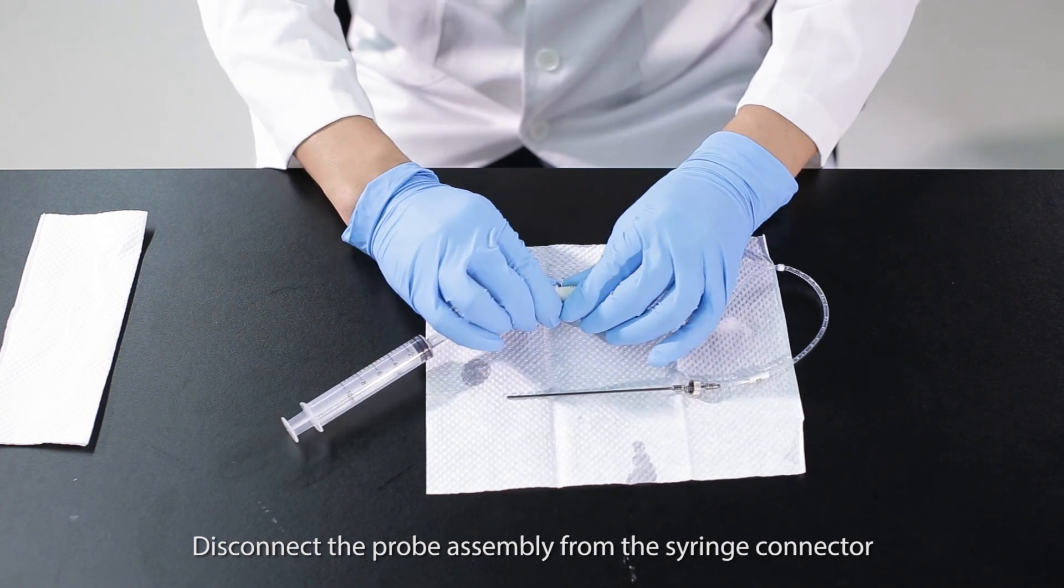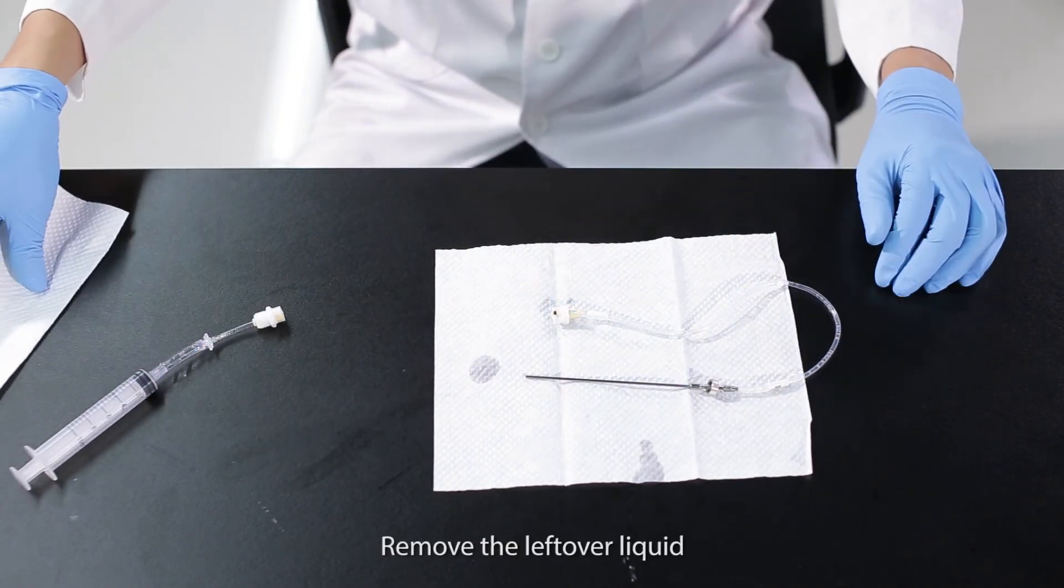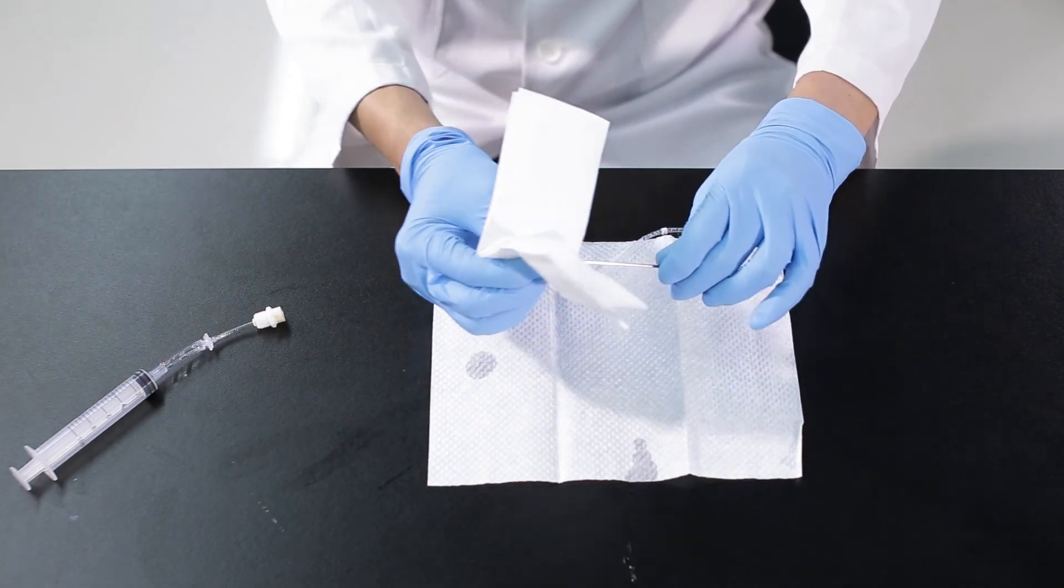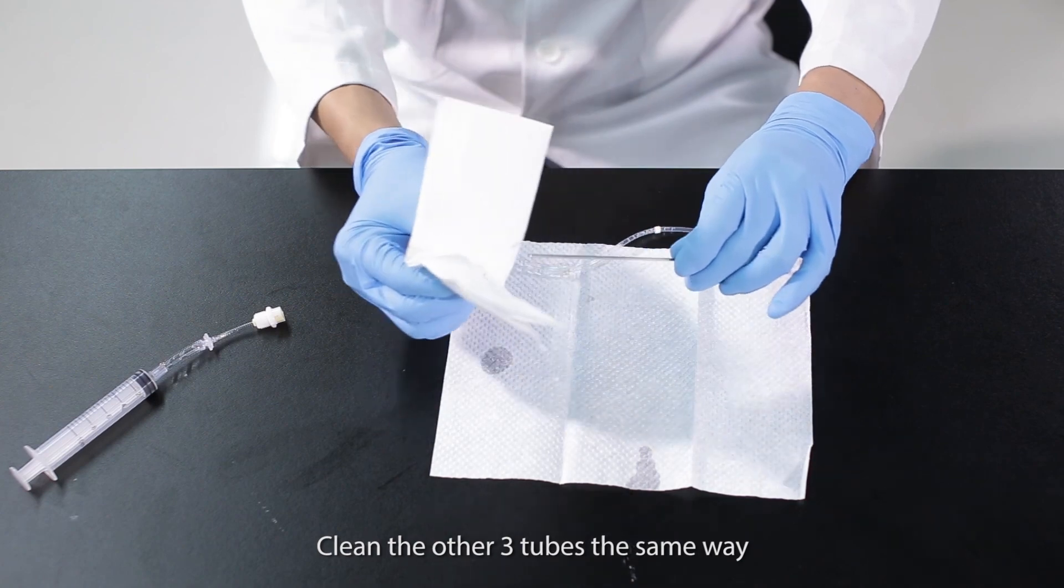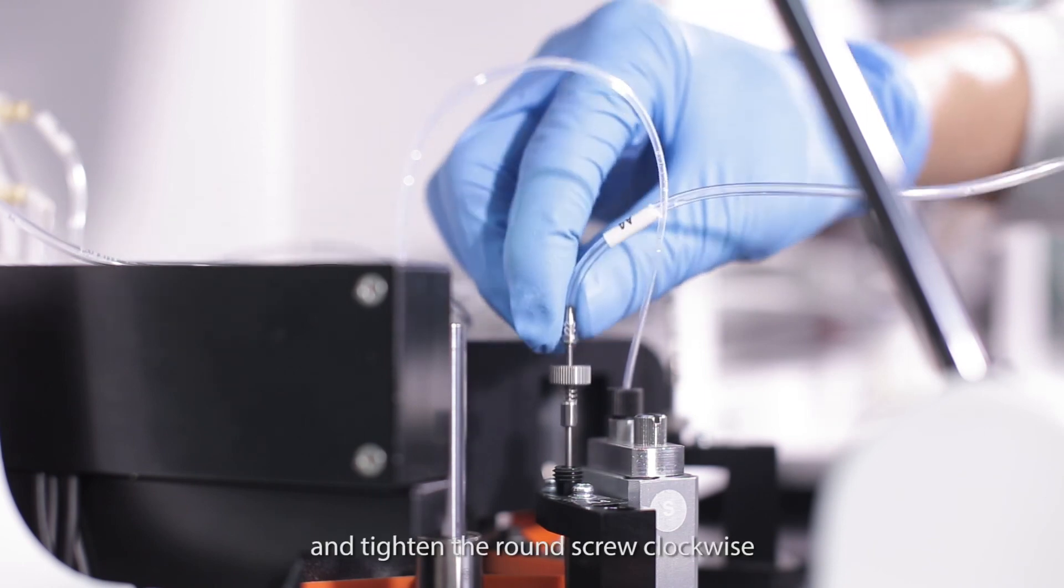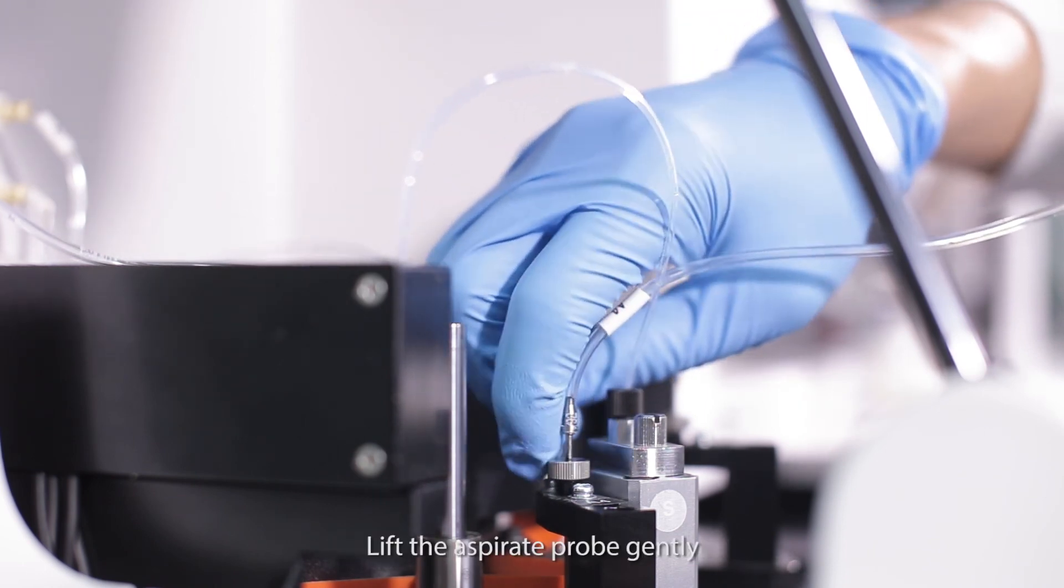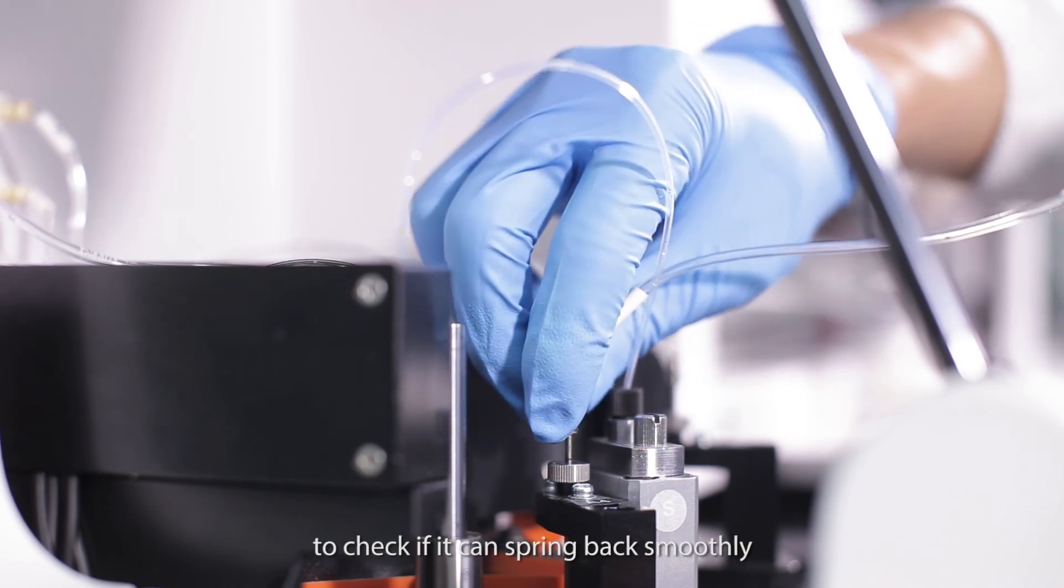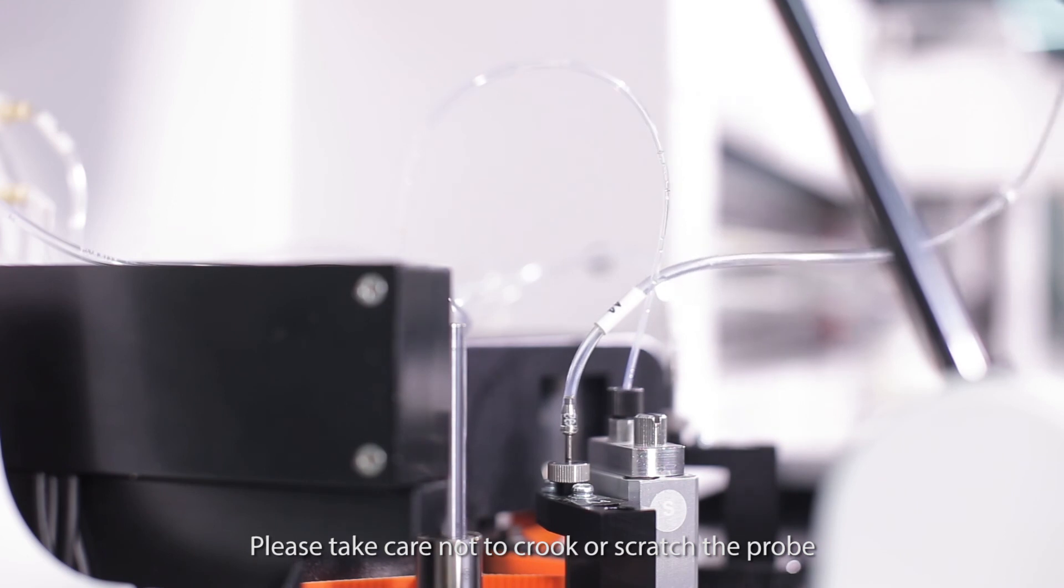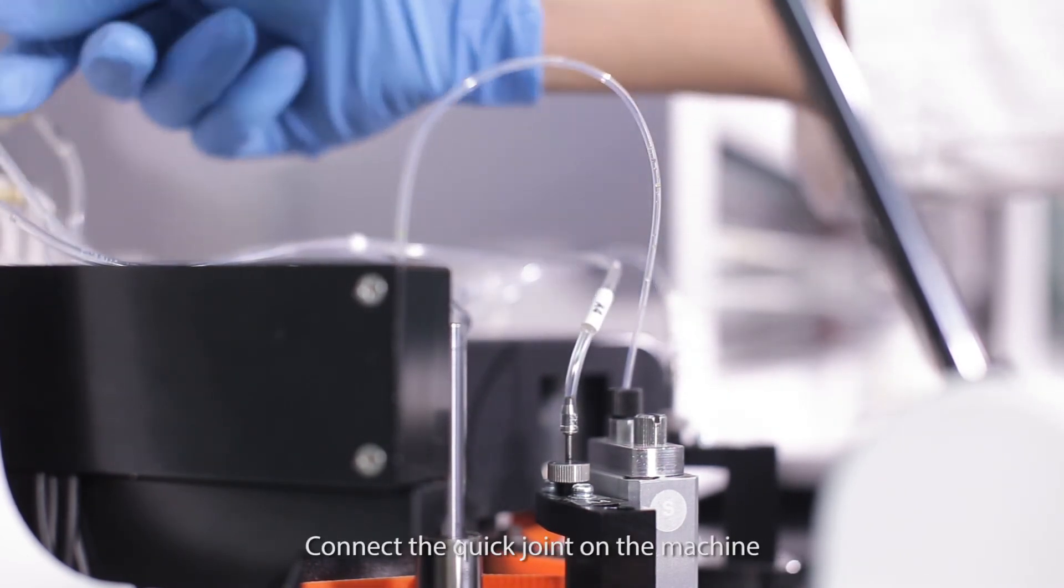Disconnect the probe assembly from the syringe connector. Remove the leftover liquid and use clean tissue to dry the probe exterior. Clean the other three tubes the same way. Install back the probe on the plate and tighten the round screw clockwise. Lift the aspirate probe gently and check if it can spring back smoothly. Please take care not to crook or scratch the probe. Connect the quick joint on the machine.